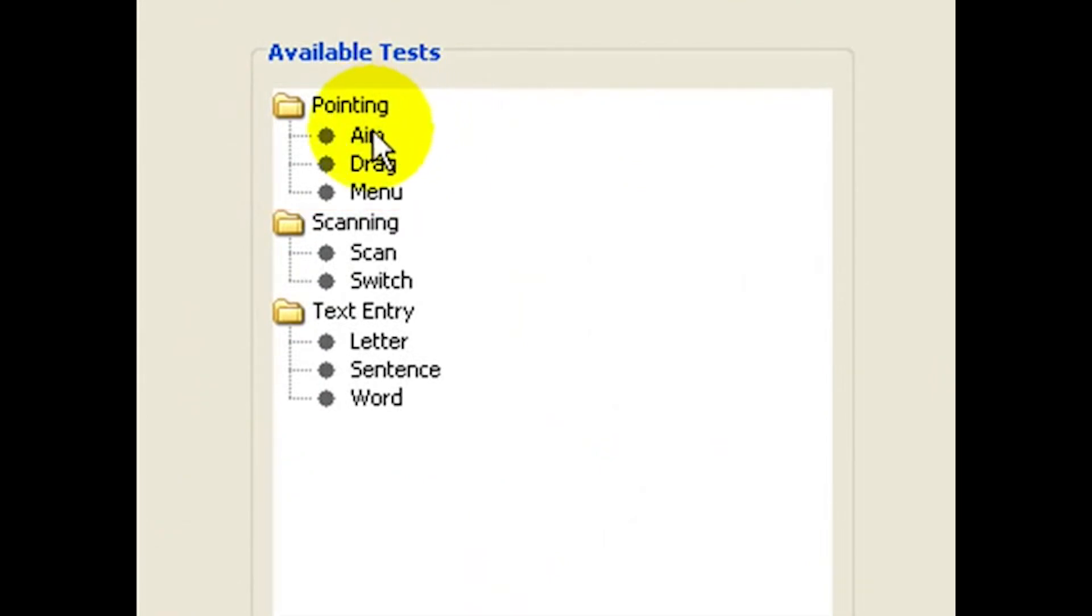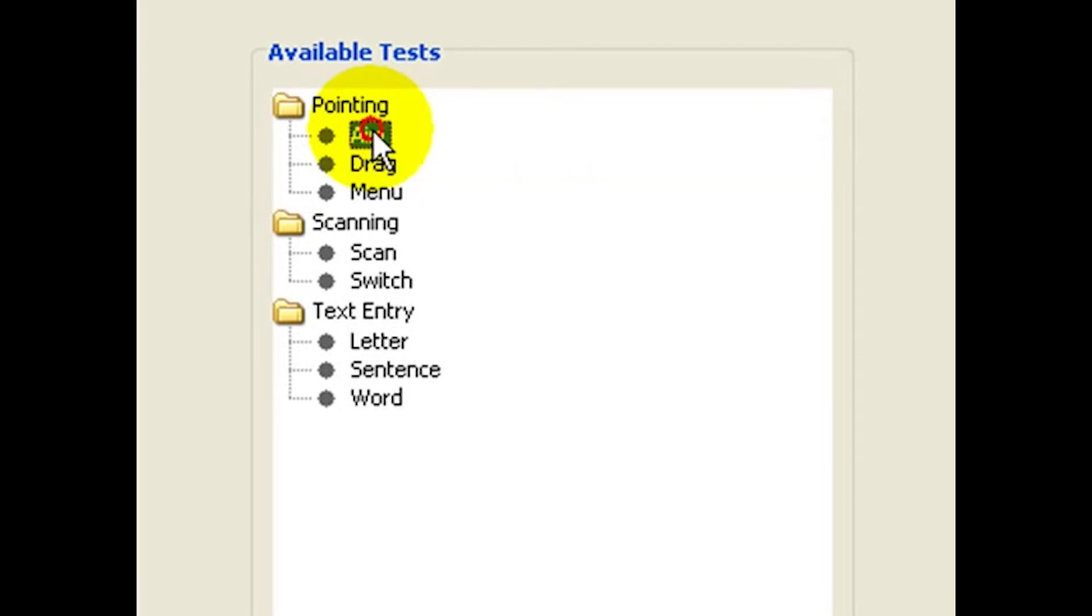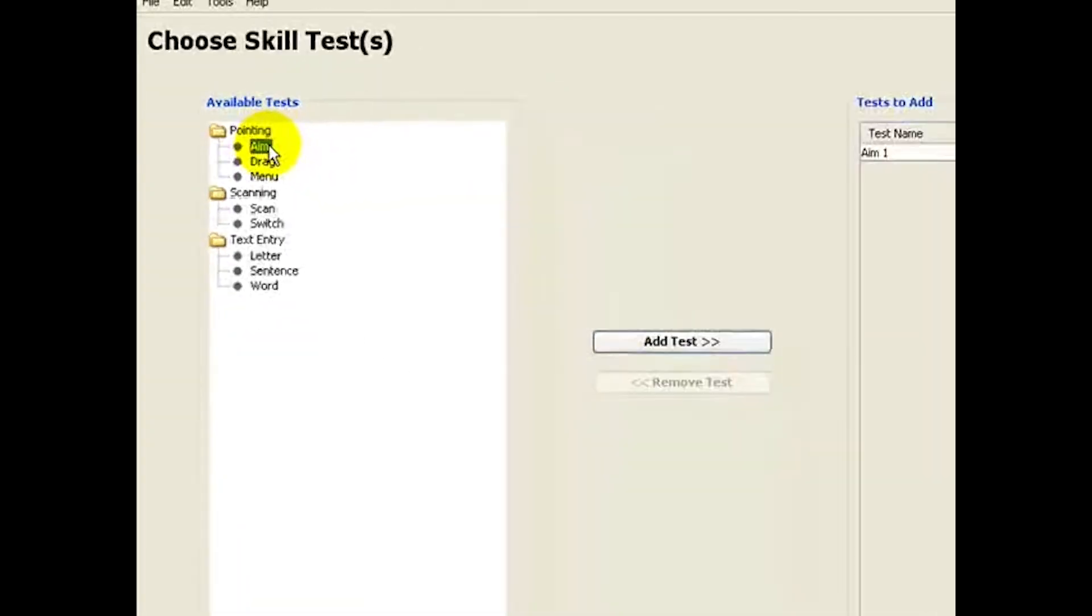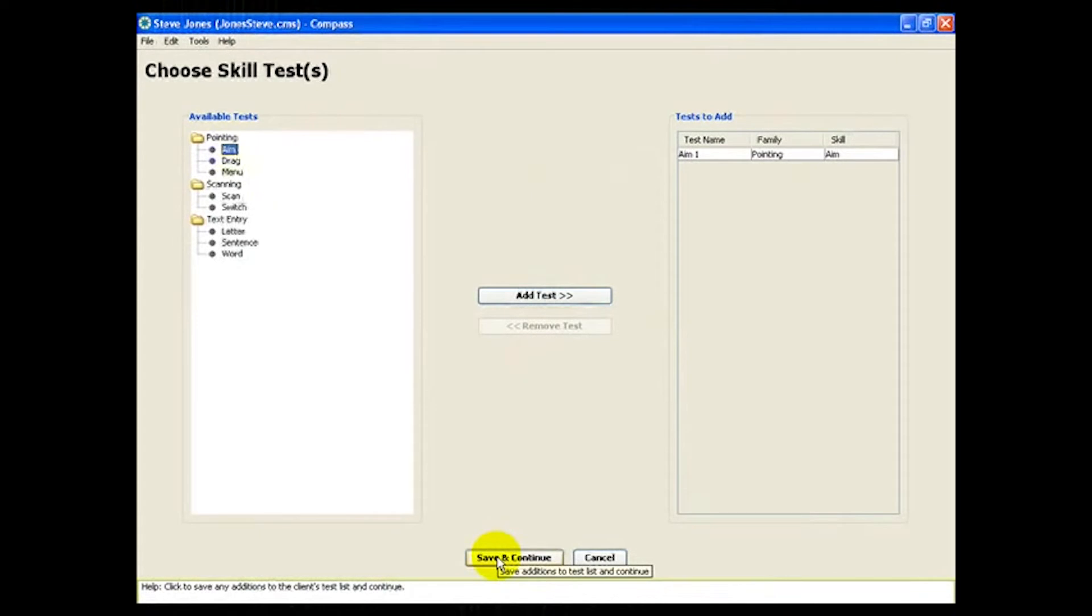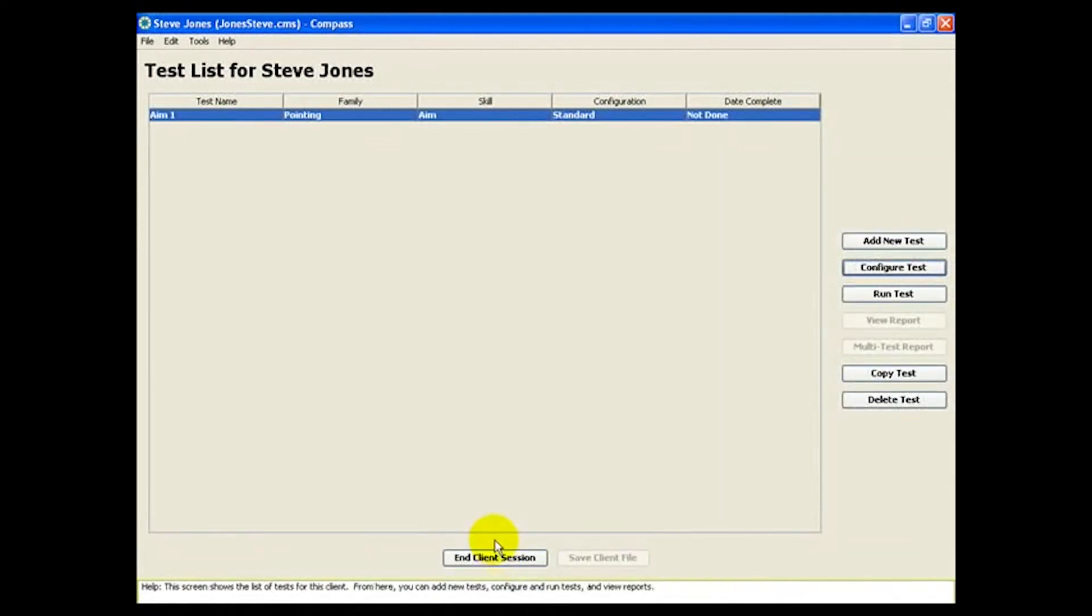which measures target selection. So let's select an aim test and get some basic baseline information on how well Steve can use his current mouse.